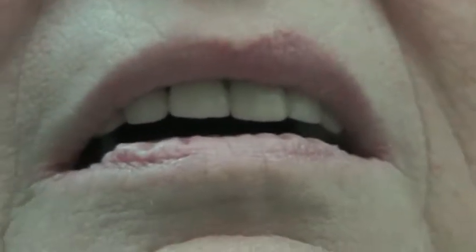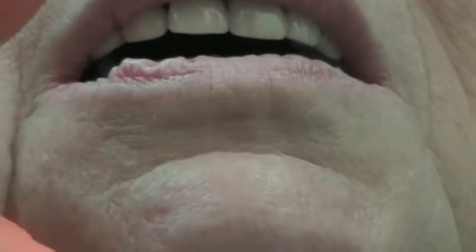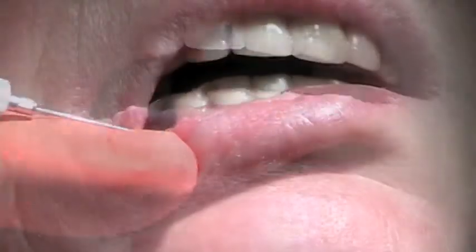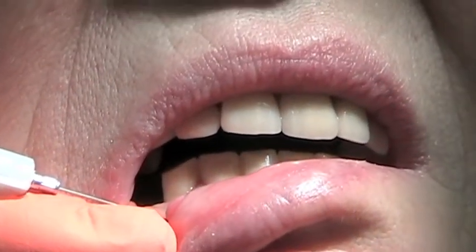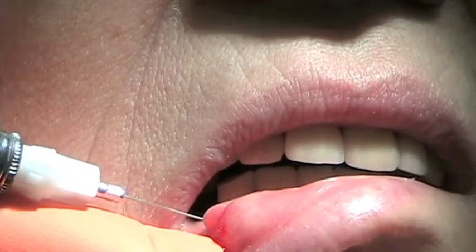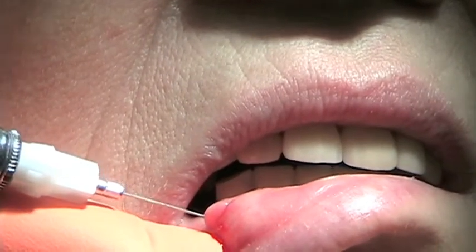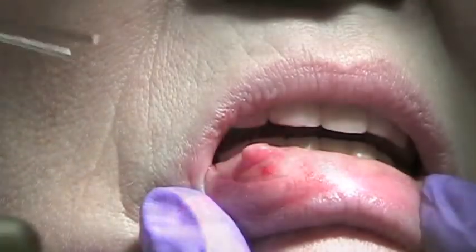Now we are going to numb up with a couple of drops. None of this should bother you.